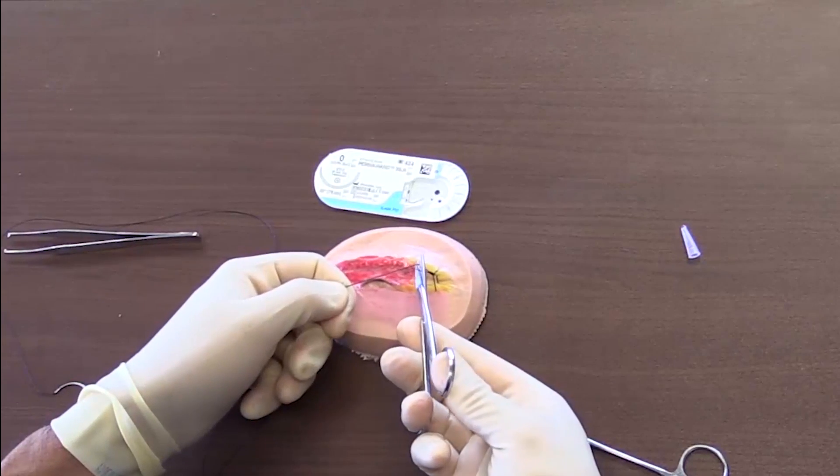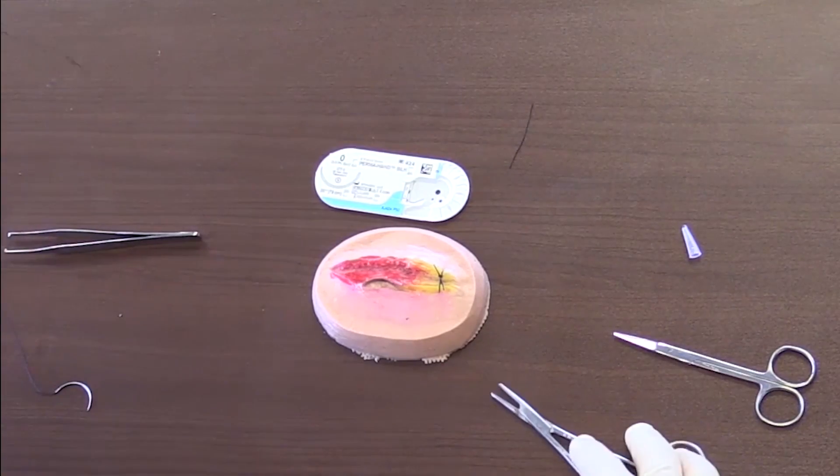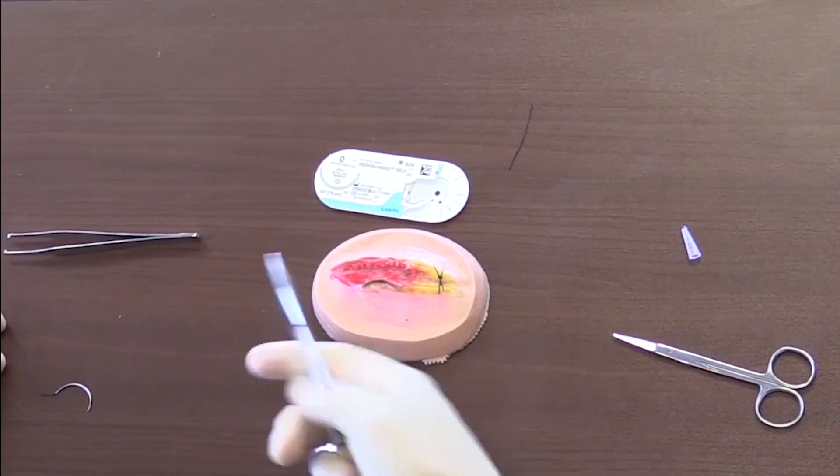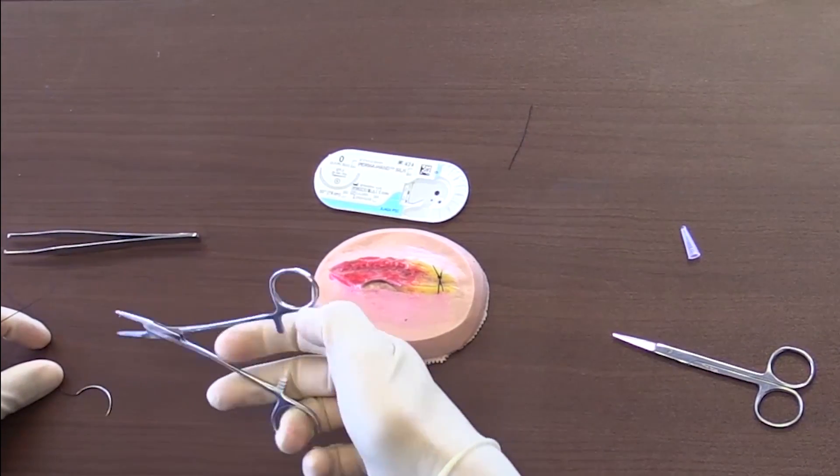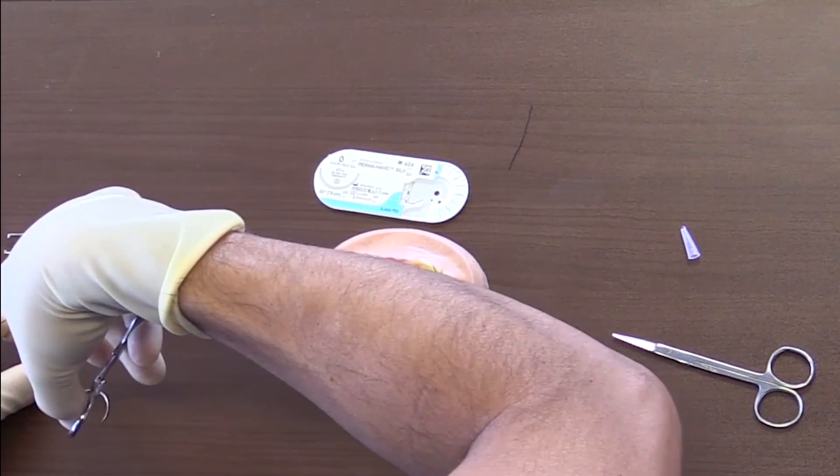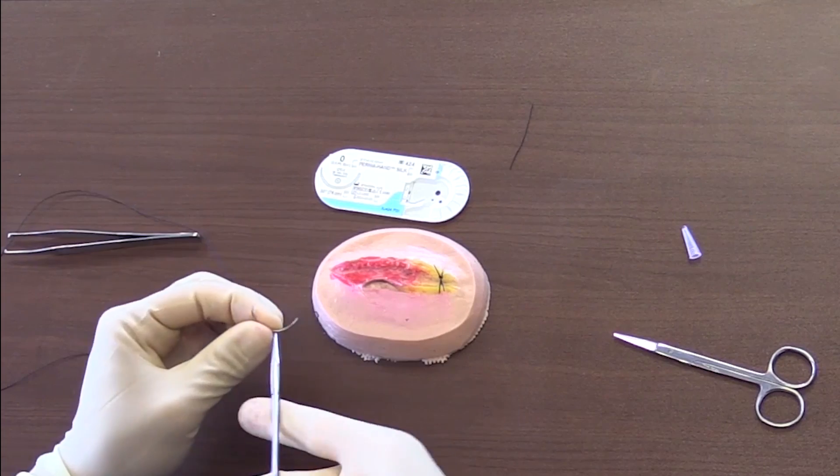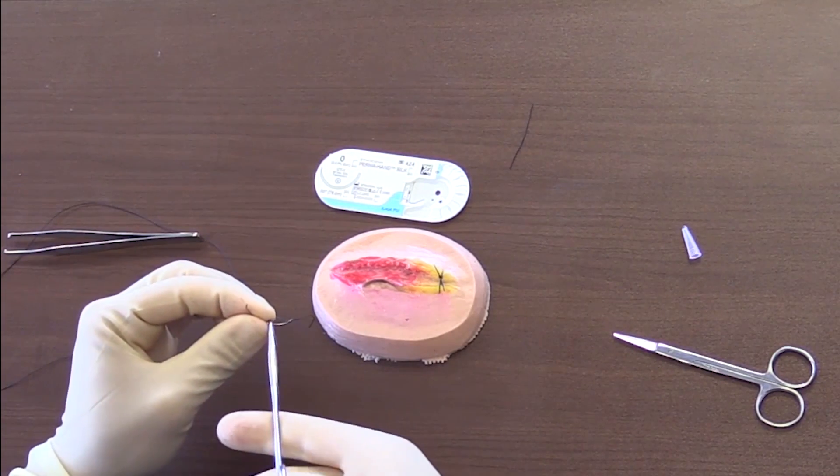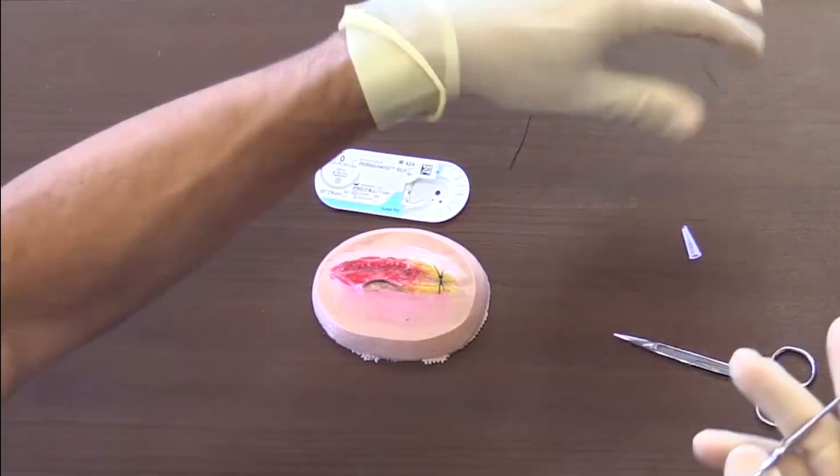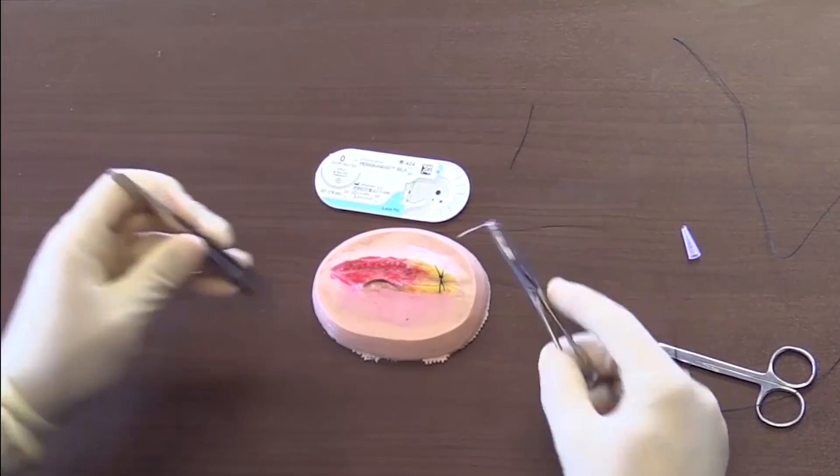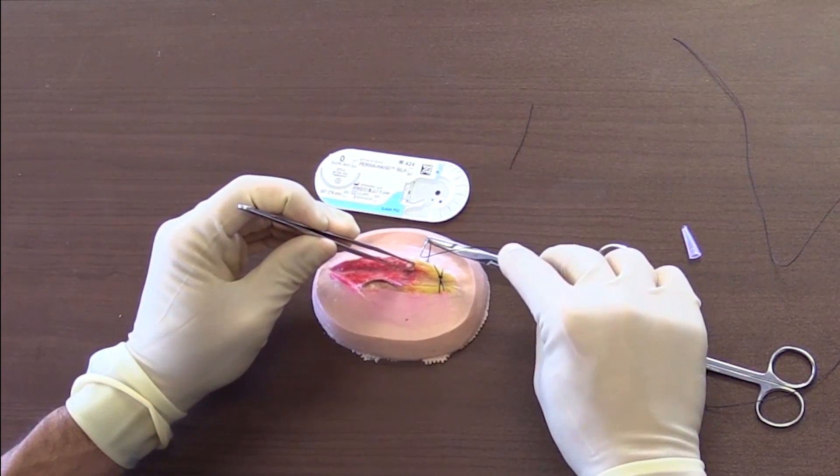In order to practice your ties, you may not have this sample wound, so you have to practice on different things. I see a lot of people practice on their scrub pants or whatever it is, but I'm just going to, for demonstration purposes, practice here. And now we're going to show you how we do a two-handed surgical tie.